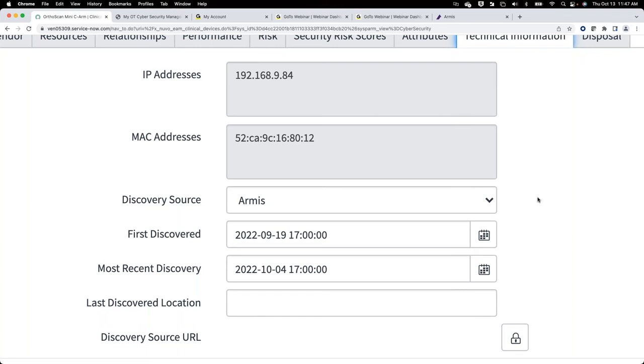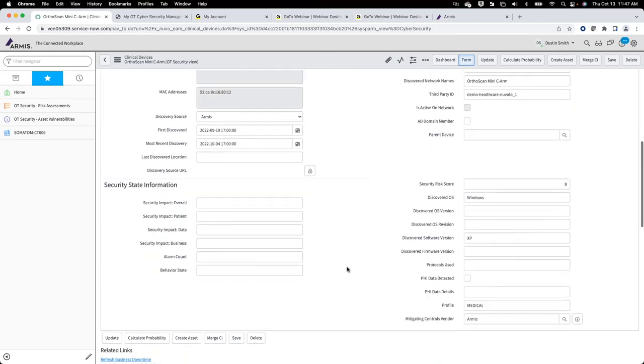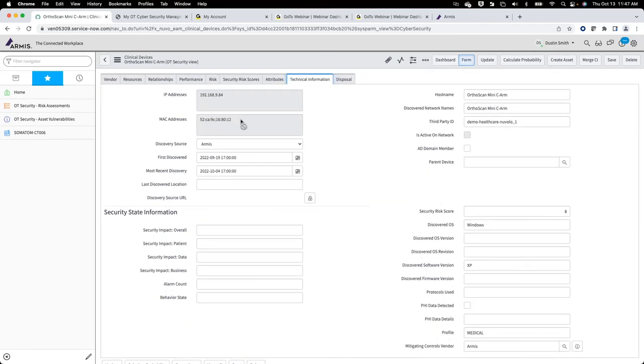No, this is automated. Almost everything on this tab is automated. The one element that I strongly encourage everybody to think about as you're going through your cybersecurity journey: put in your MAC address. Start that work today. There needs to be a tie-out. Serial numbers, if it's in the packet, they're going to catch it, largely. But unfortunately, not all serial numbers are in the packet. So you do need to do some level of manual work to ensure that we have that match in the beginning.